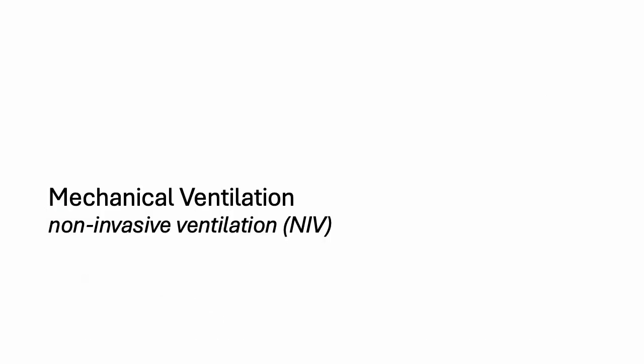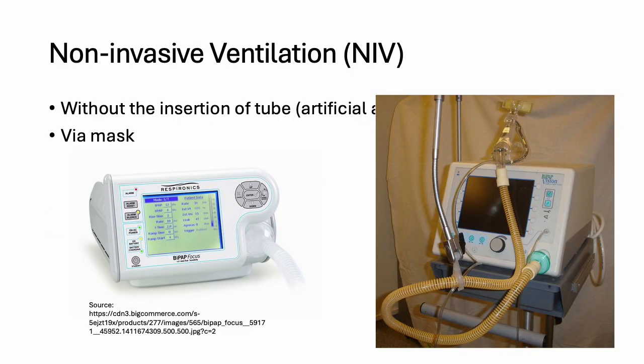I need to talk a little bit about non-invasive ventilation. So we mentioned before, it's just the application of mechanical ventilation without the insertion of an artificial airway. So it's through a mask, and the mask can be applied over the nose or over the entire face, covering the nose and the mouth.